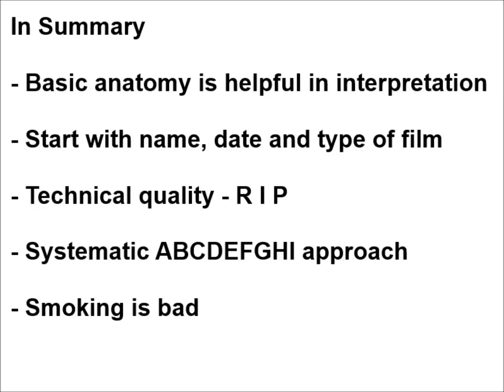Now that we've reached the end, it's time to summarise what you've learnt. A little bit of background anatomy goes a long way in interpreting chest x-rays. Start with the trivial stuff before diving into trying to diagnose the patient. Remember to comment on the technical quality using RIP. Use the A, B, C, D, E, F, G, H, I approach, and remember that smoking is bad for you.